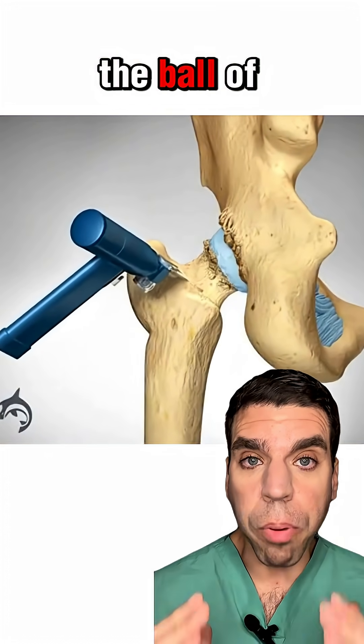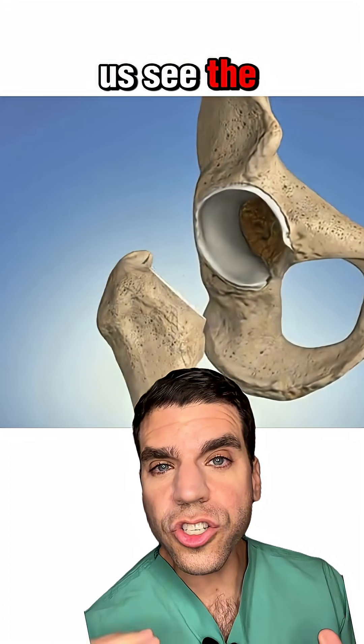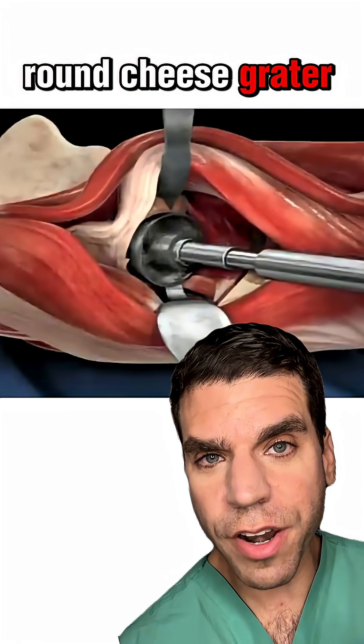Then we find the neck and the ball of the hip joint and we cut out the diseased bone. That lets us see the socket underneath. We smooth out the socket with a tool called a reamer that kind of looks like a round cheese grater on a drill.